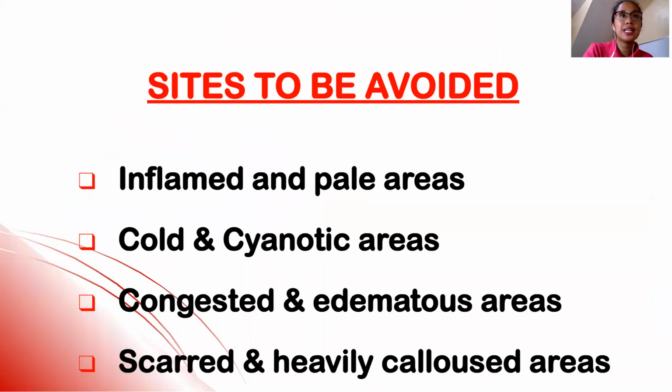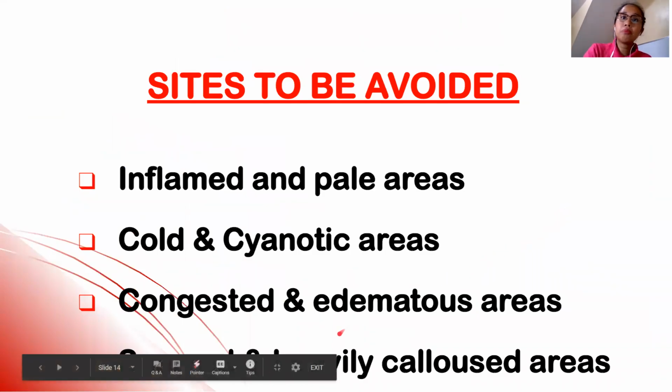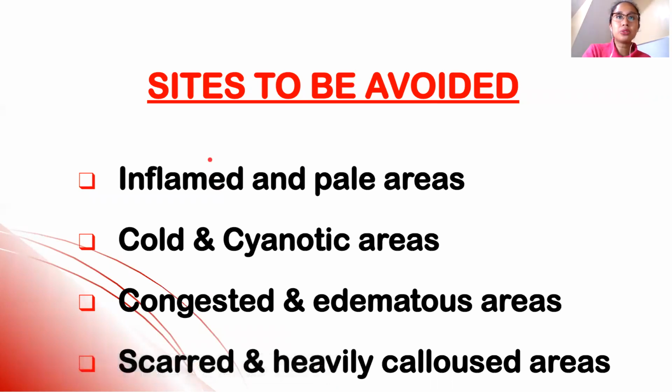According to CLSI, in your skin puncture, you have to avoid inflamed, namamaga na nga, wag mo na tusukin. Okay? Cold and cyanotic. So, if you have a warmer, or if you have a warm towel, then please allow them to use it first. Congested and edematous area. So, class, when you're going to extract on edematous area, most probably tissue fluid na yung makukuha mo. So, you have to repeat. Find other areas where there is no accumulation of fluid under the tissue.